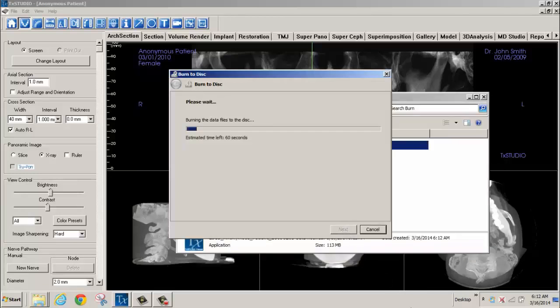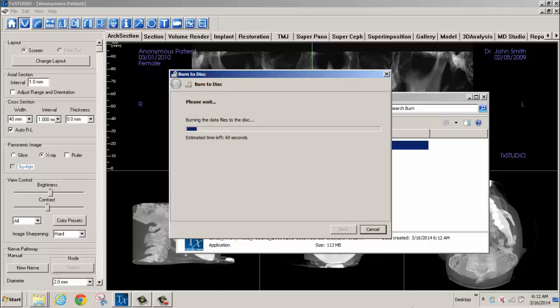The case and the Treatment Studio Viewer, unless you choose DICOM only, will be written to the CDR. The burner's tray will open upon completion.